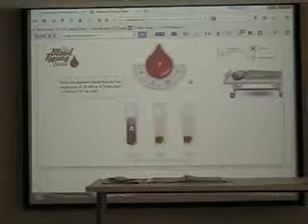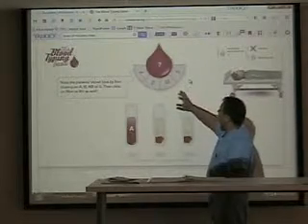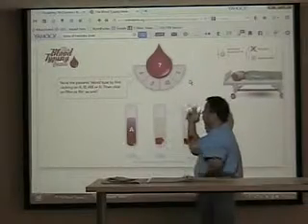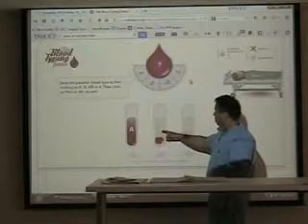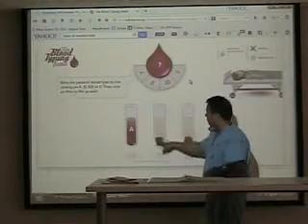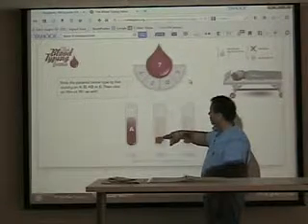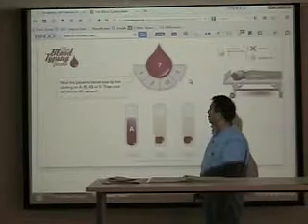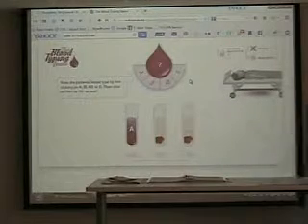Before we answer any question, remember, it's even helping us. First we have to figure out the ABO system. And remember, the ABO system is what? Just the A and B tubes. So is there any reaction in A? No. Is there a reaction or agglutination or clumping in B? Yes. So there's B antibodies in the original tube, and when we added the blood, that means there's B antigen present. So my patient's blood type is B. So let's click on B, let's see if we're right.